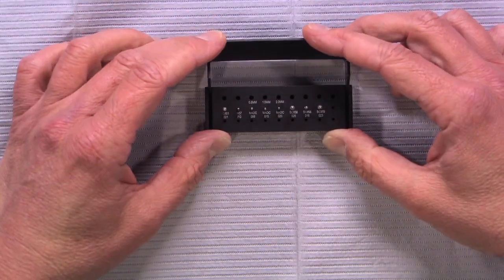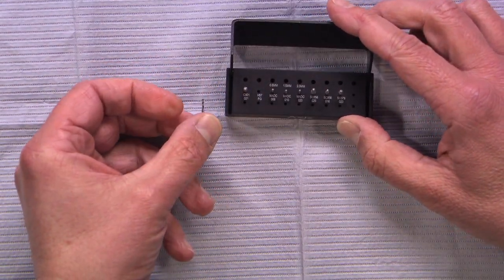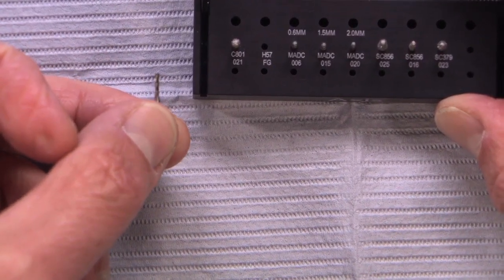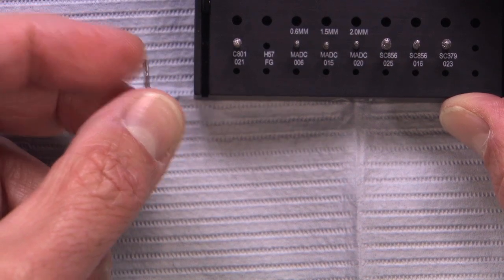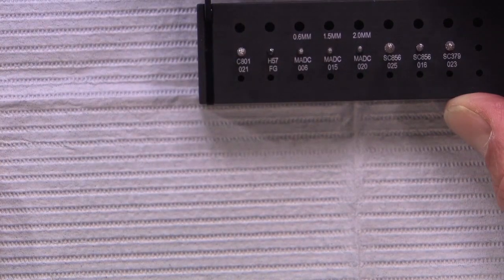So I wanted to just show you the burrs on the kit first before we get into the technique. The first one's a simple 57, it could be a 56, 55. The only thing we don't want to use is a cross cut, you know, the 556 and 557, because they cause a lot of damage, a lot of shattering of the enamel around the area while we're working and beyond it, even into the dentin as well.